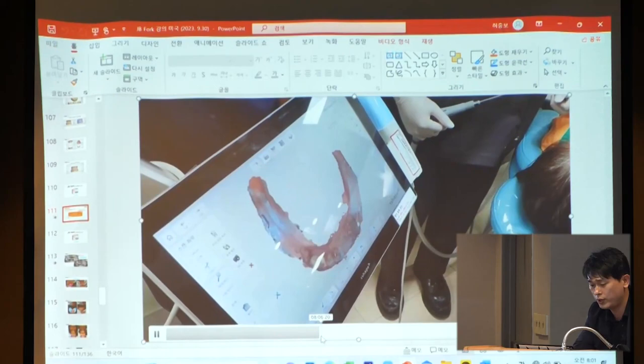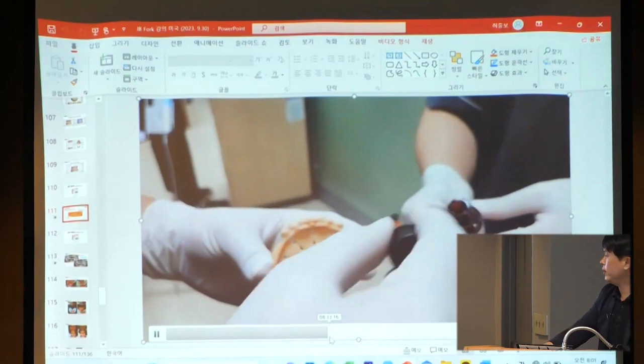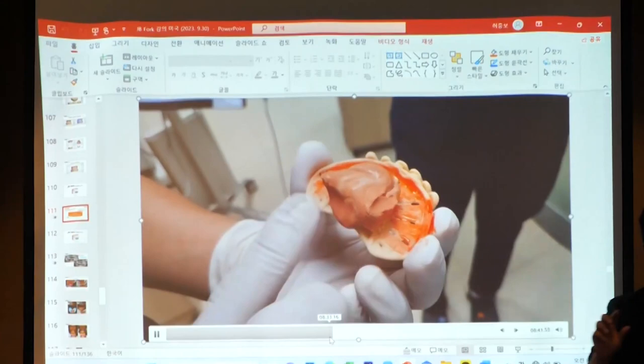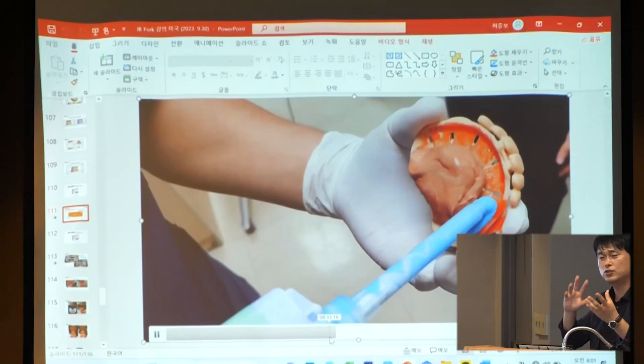This patient has flabby tissue. Do you know flabby tissue? There is no bone below the gums. So at that time, after applying the silicone material and adhesive, you have to position the body in the palate area, not the anterior part. Do you understand? Because when pushing the silicone material, the flabby tissue can change position, so it disturbs the merging together.